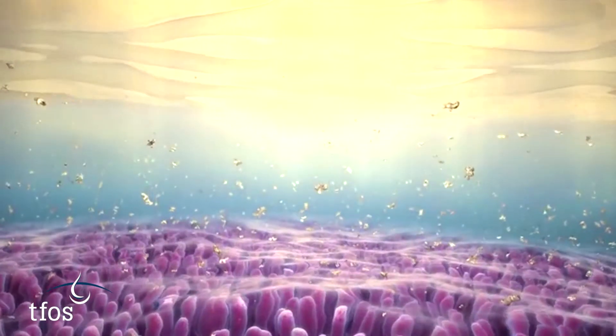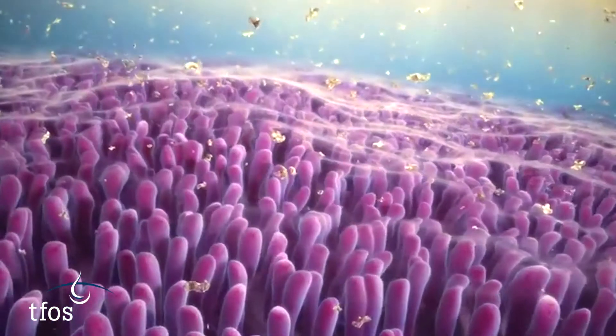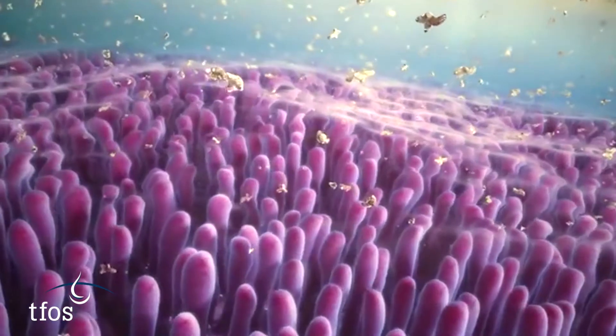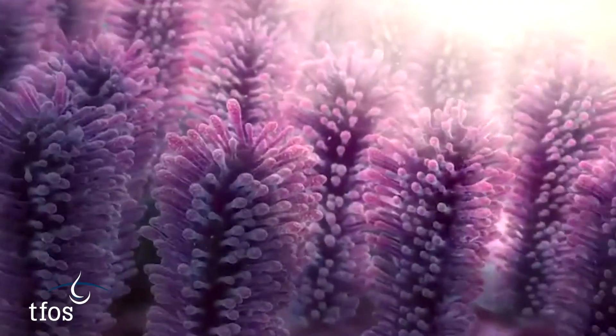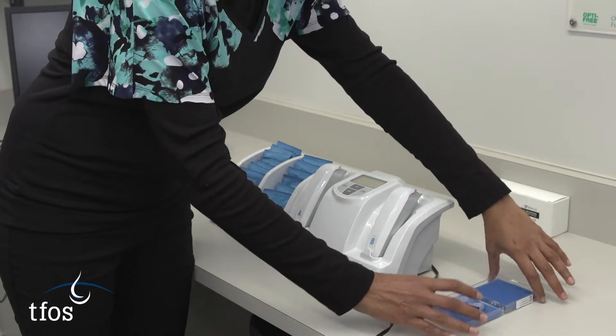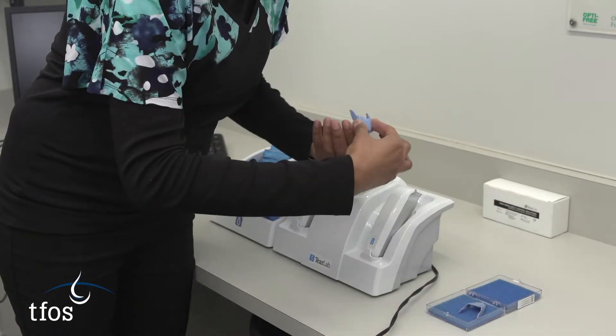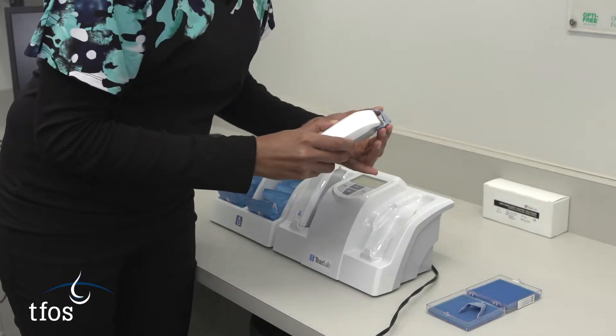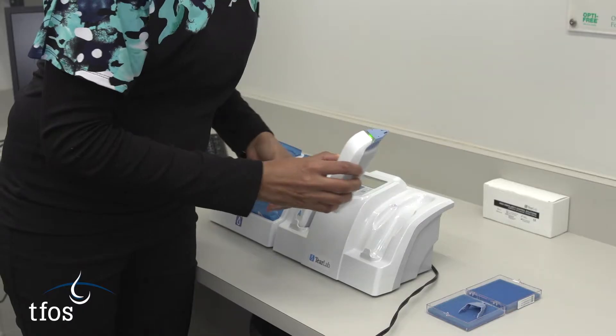For the current commercial device that measures tear osmolarity in a clinical setting, it is recommended that the device is switched on well in advance of the measurement to ensure equilibrium. The test card should be stored adjacent to the device for temperature consistency. Each day before measurements are collected, calibration of the pens is checked with the blue calibration test cards provided.